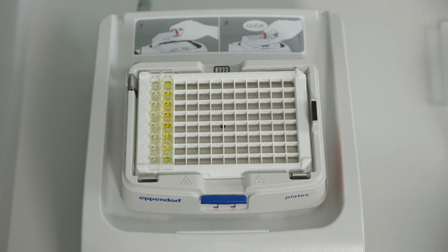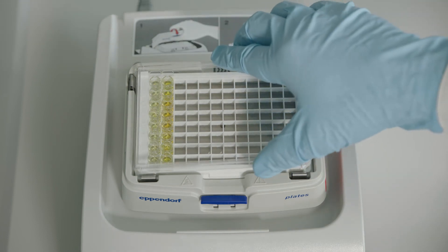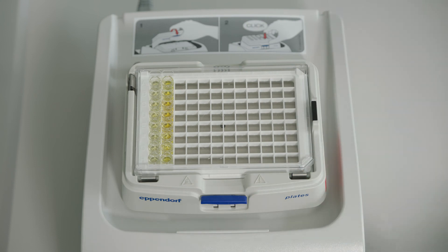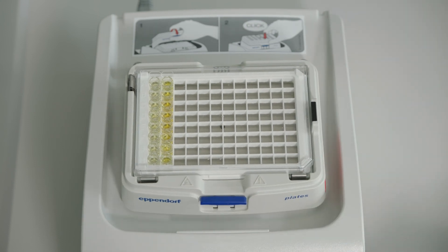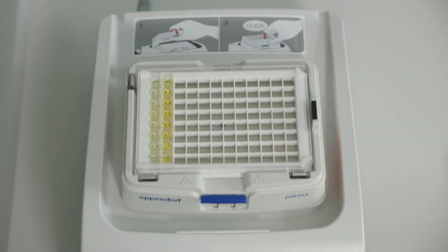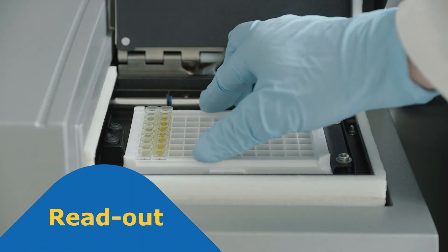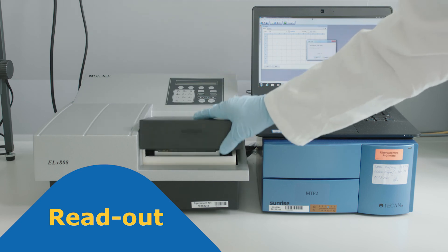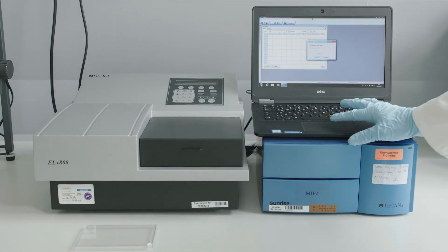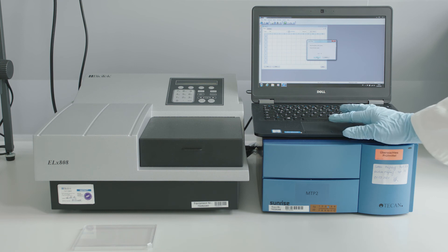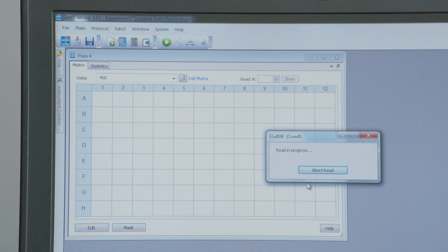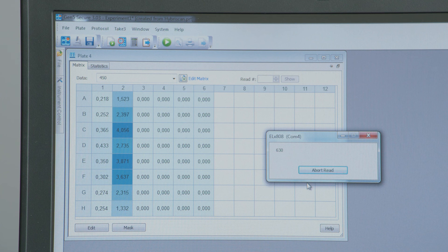Place the microplate in a microplate reader and measure the optical density in each well at 450 nanometers. The blank and negative samples should be white to slightly yellow, while positive samples or controls should show a stronger yellow tone. Qualitative results can be read with the naked eye after placing the plate on a white background.